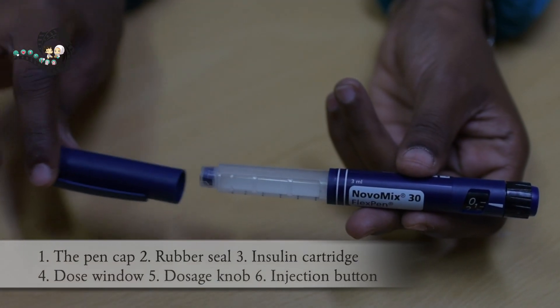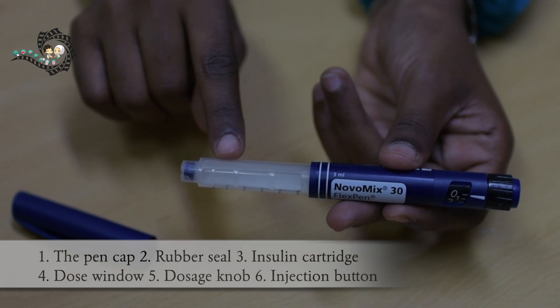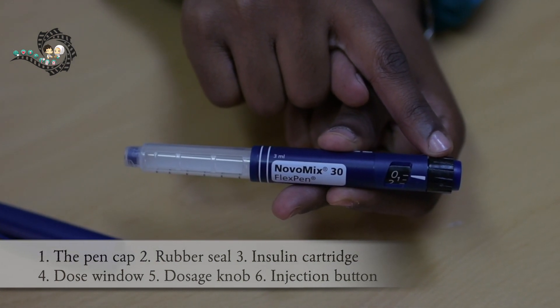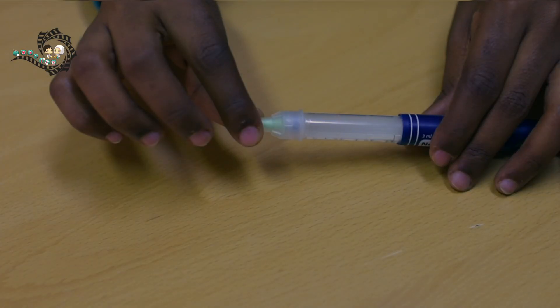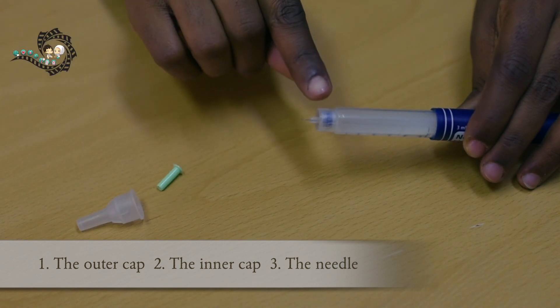Here are the insulin pen parts: the pen cap, rubber seal, insulin cartridge, dosage window, dosage knob, and injection button. The pen needle consists of the outer cap, the inner cap, and the needle.